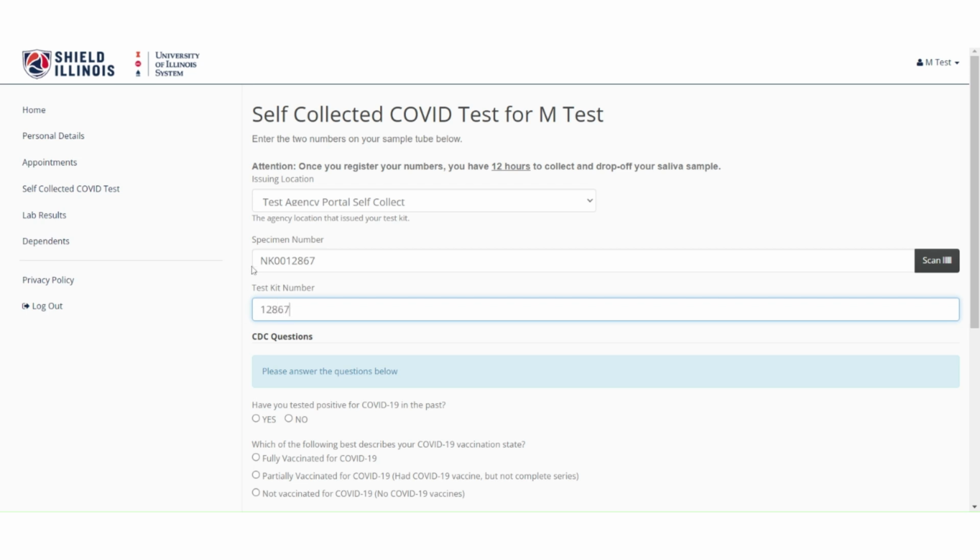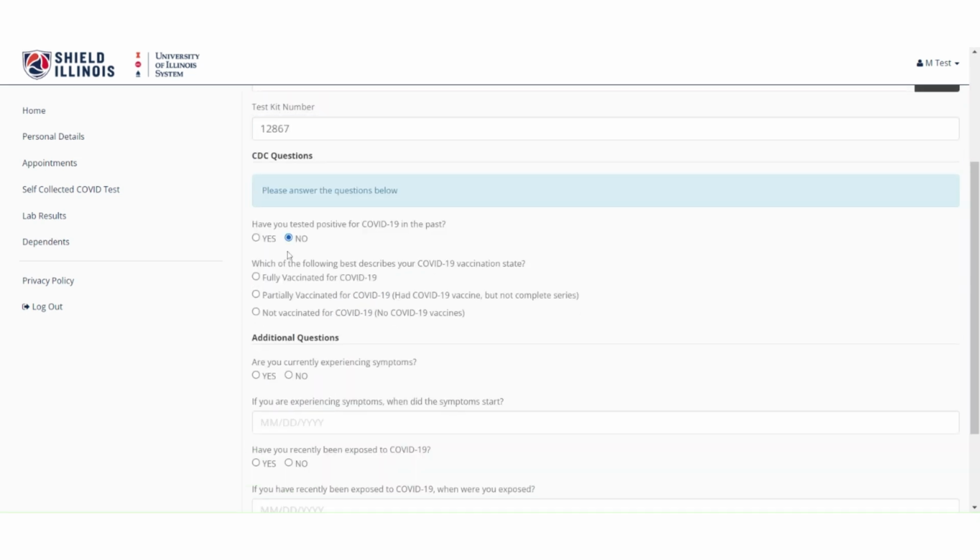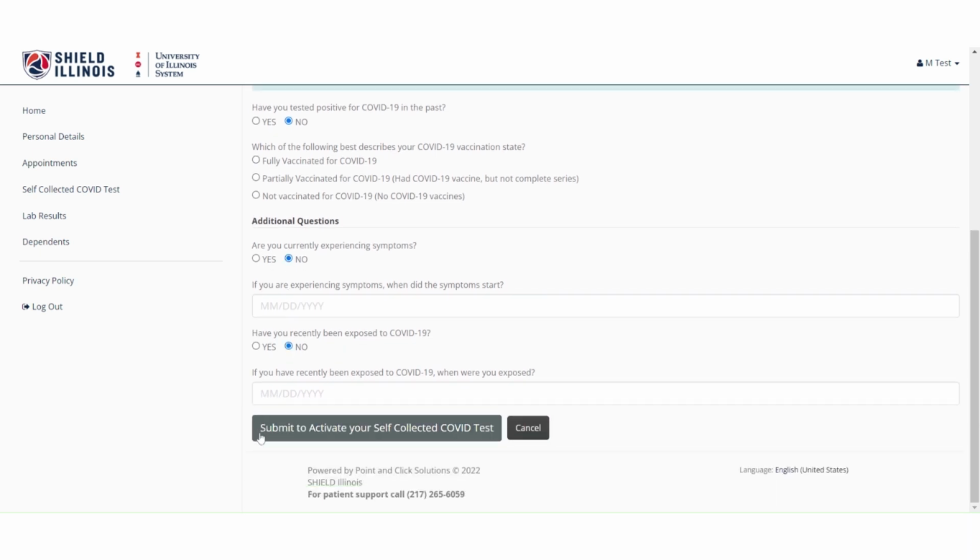You will then answer a few questions required by the CDC. At the bottom of the page, you will see a button that reads Submit to activate your self-collected COVID test. This is very important. Your test is not submitted until you click this button. Click on Submit to activate your self-collected COVID test. This will connect your specimen with the label from your test kit.